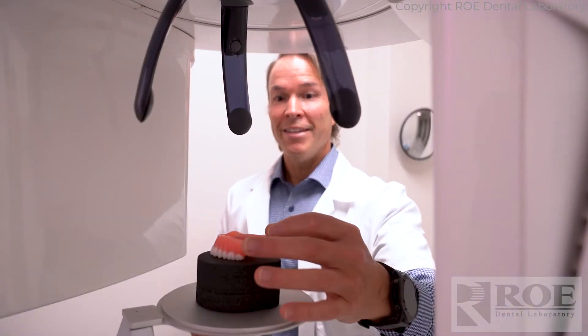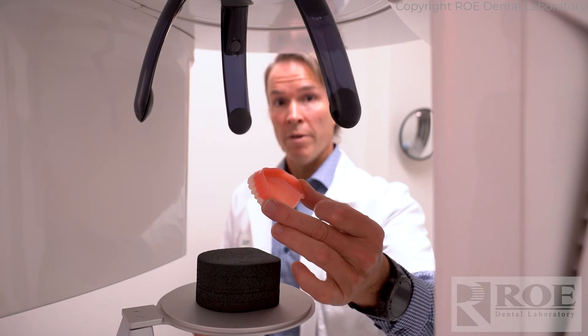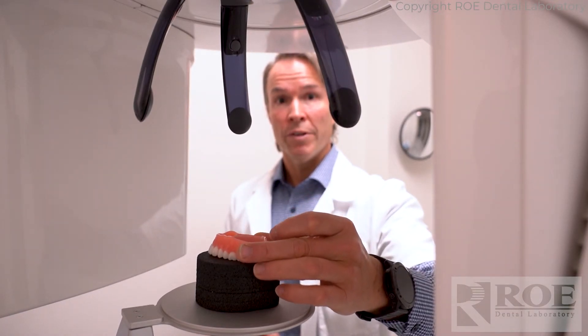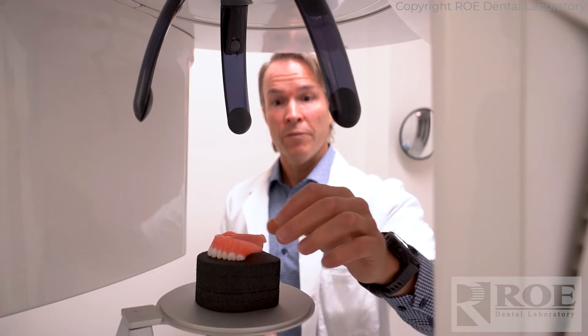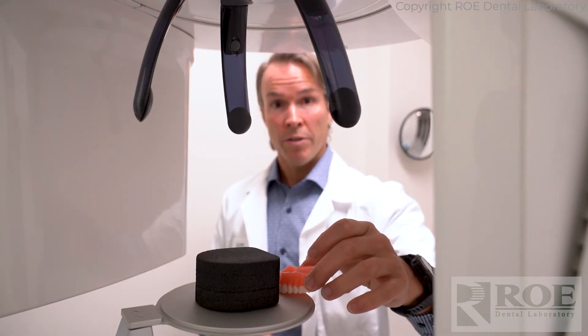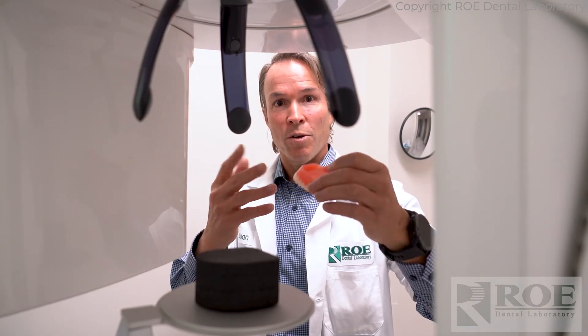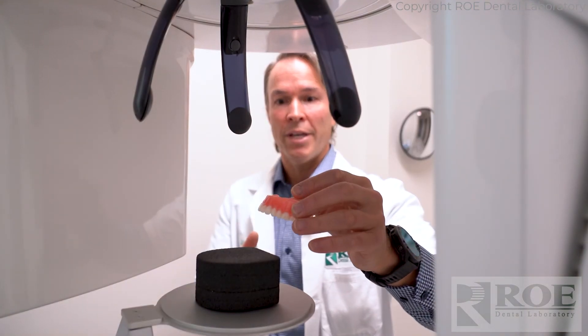When you capture your CT scan, it's very important that the denture is sitting on foam, cotton rolls, or something that raises it above the hard surface. If it's sitting on a hard surface, the teeth and the plate all kind of mesh together and we just can't separate the two — and you'll have to scan again.